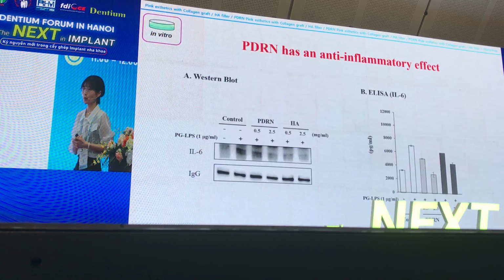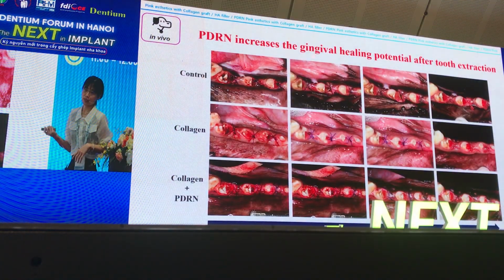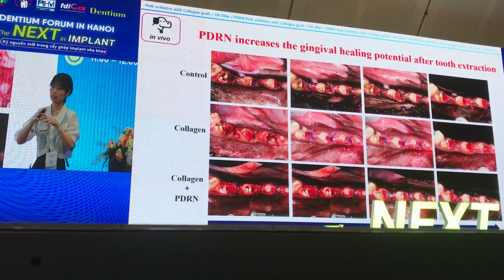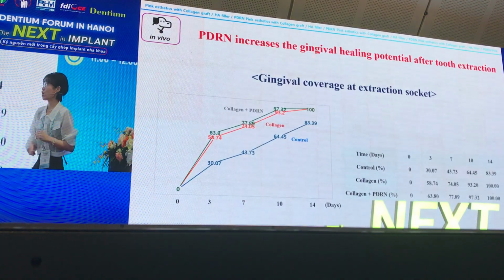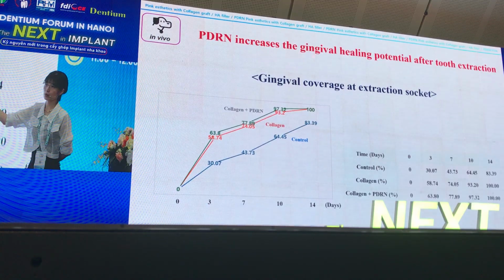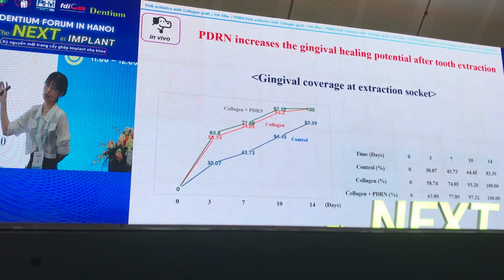inflammation. So I applied PDRN after tooth extraction for soft tissue healing. I compared the control, simple application of collagen graft, and soaking PDRN in the collagen graft.